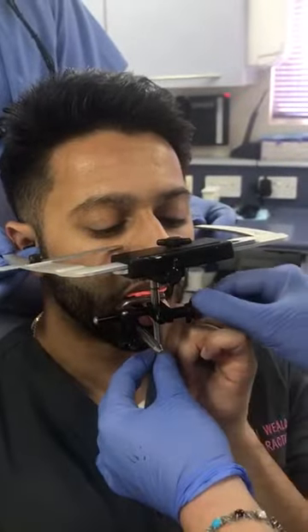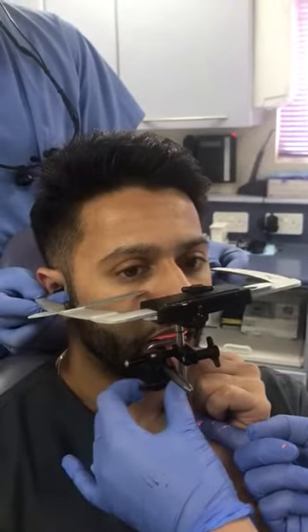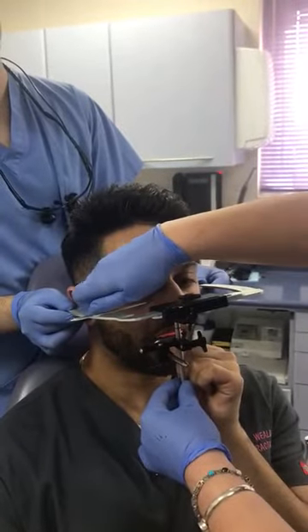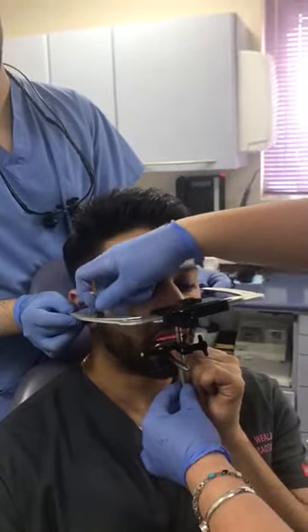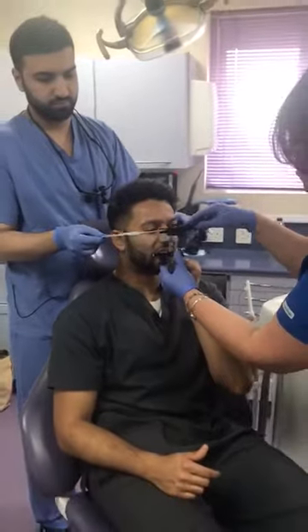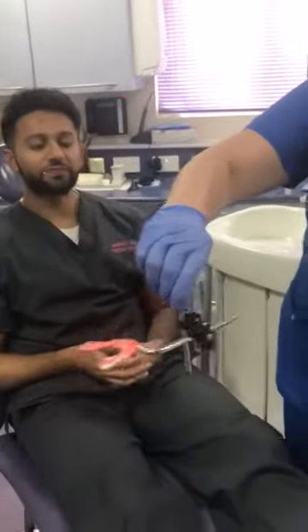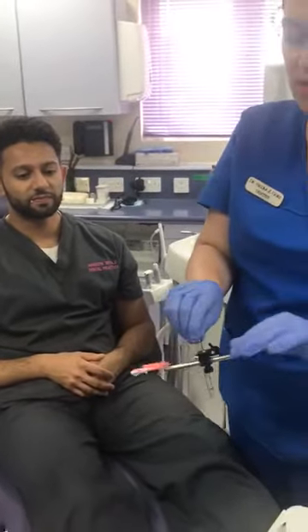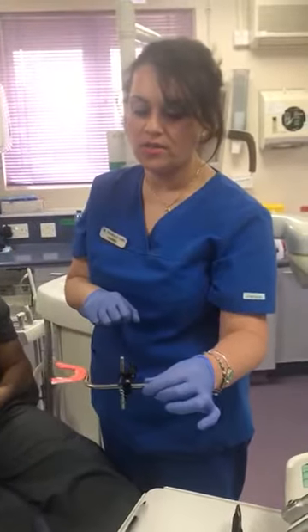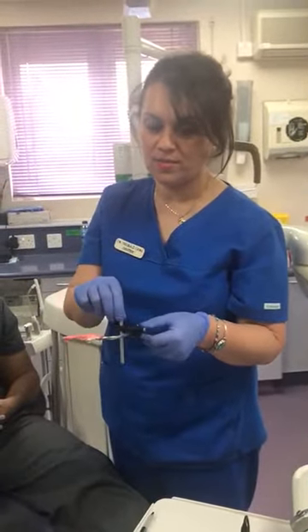Once you're happy that all your teeth are sitting on the bite fork in your stone bite, you tighten number one and you tighten number two — just finger tight. Then you double check everything, and if you're happy, you open this, undo it, and tell your nurse or colleague to take that off and let go. Open wide, and then this will go to the lab. It's essential that this doesn't get bent, because this is what the technician will put the cast on to mount it on the articulator. Make sure your nurse doesn't bend it. So this needs to go in a box like this.